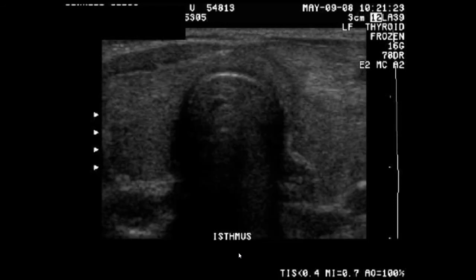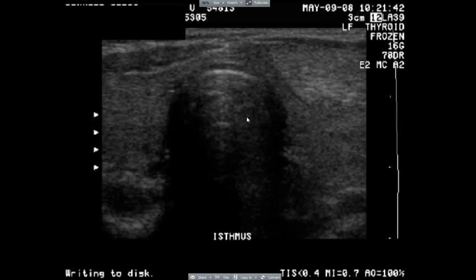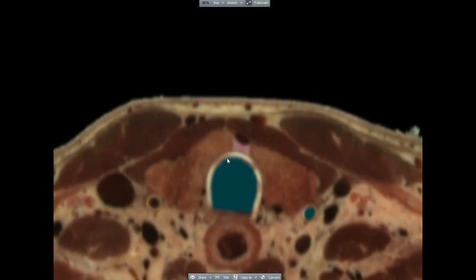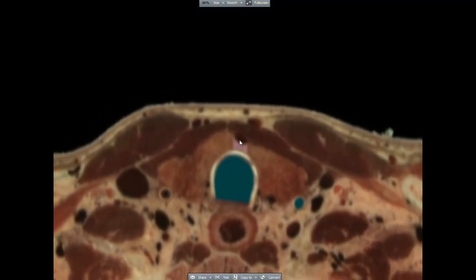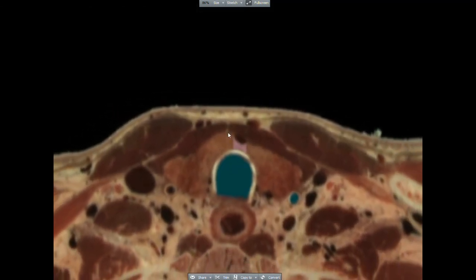In this image, the ultrasonographer has labeled the image as the isthmus, but we know this because we can readily identify the trachea, the isthmus, and portions of the left lobe and the right lobe.